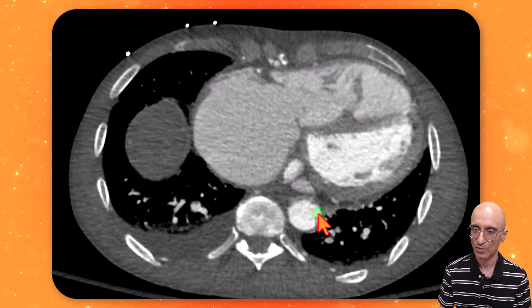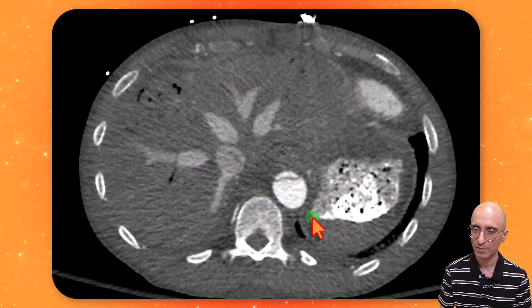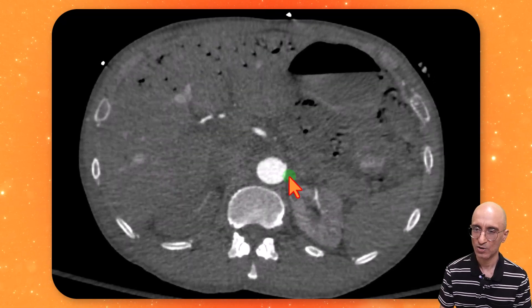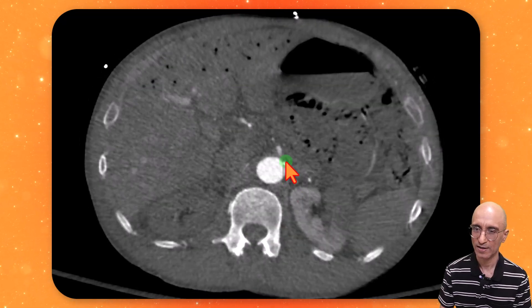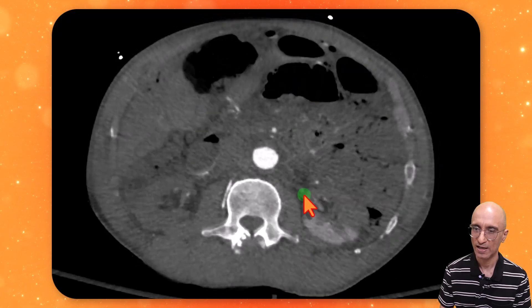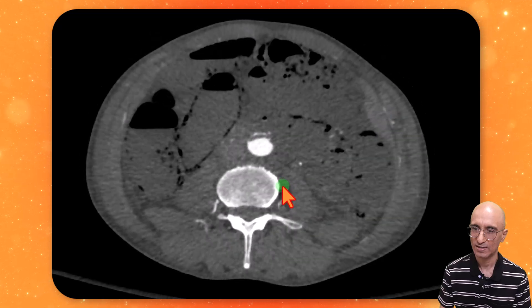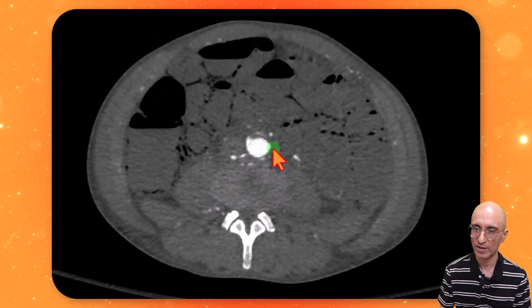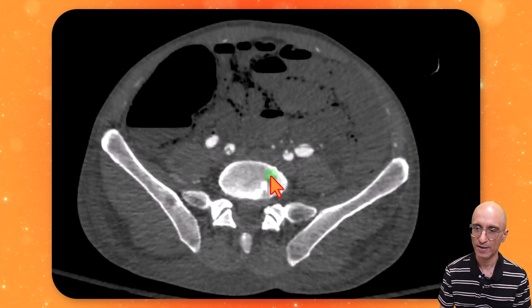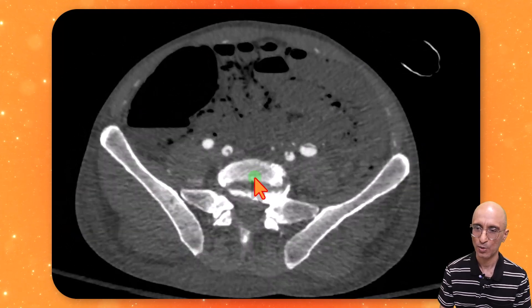Scrolling inferiorly, you can see the true lumen is extremely slit-like and the origin of the celiac artery is not opacified. This is the origin of the SMA, which is occluded proximally and reconstitutes distally. Scrolling further down, we can see opacification of the IMA. The dissection flap extends into the iliac vessels on both sides.